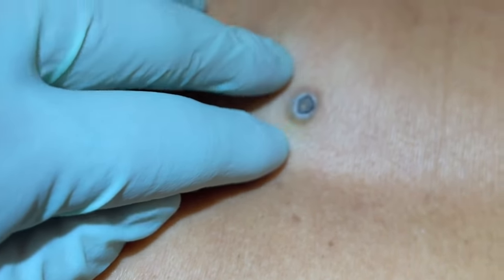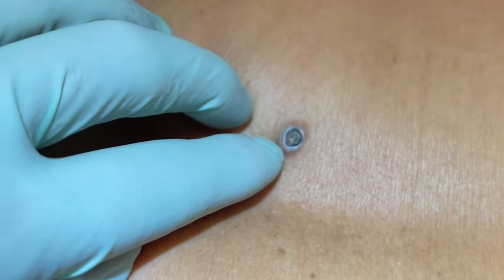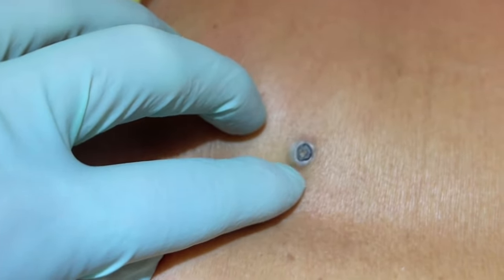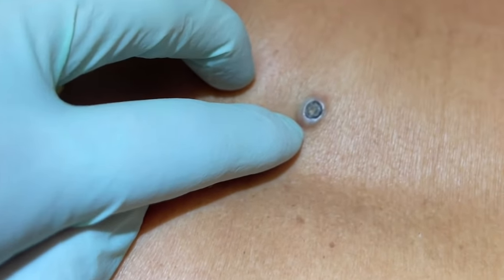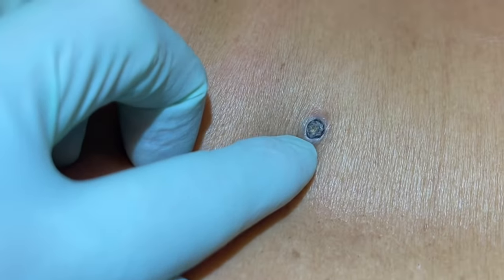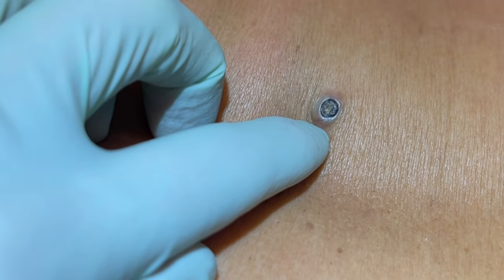You can see that oxidized kind of top to it — it turns black where it hits oxygen. So what we're going to do is loosen this up and we should be able to kind of pull this out. Sometimes I'll do a little elliptical cut and put stitches in. If the pocket's relatively shallow, we just cauterize and that will stop it from regrowing. So I'm going to numb her up and then we'll kind of push that out and see what it looks like underneath.